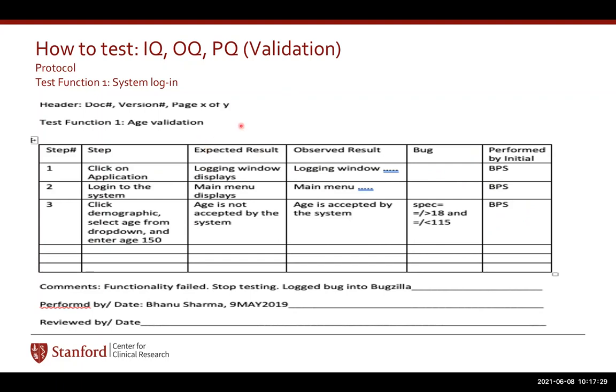So this is very important, and this is the way we do the manual testing, also called black box testing.